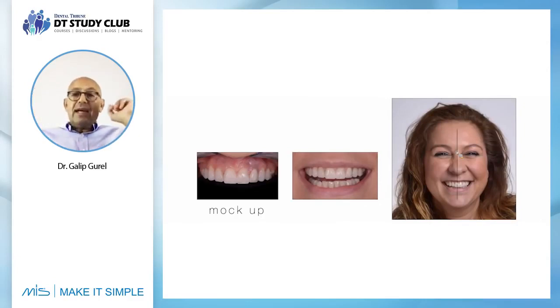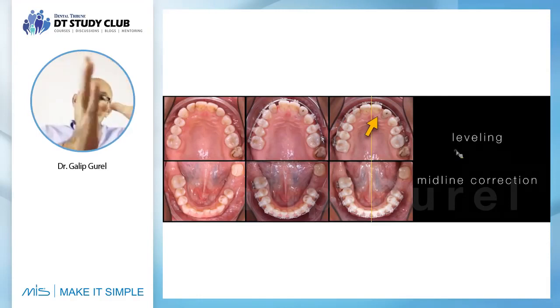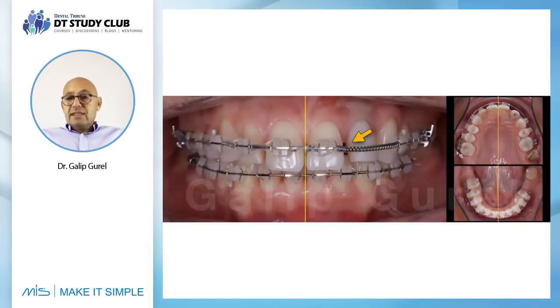So this is why we urged her to get into ortho. Nuno Diaz, a great orthodontist that we've been working with for many years, takes care of the case at this moment, and see how much it's progressing and all his efforts to bring the midline into position. Now we see a gap between the lateral and the central, after the centrals are moved towards the midline. So, as you can see the same space here, now we have to make a move on the lateral.